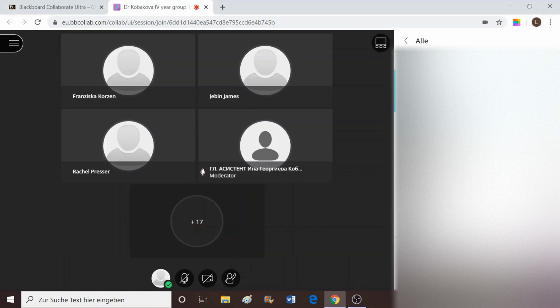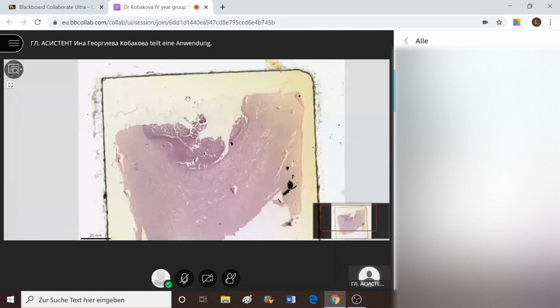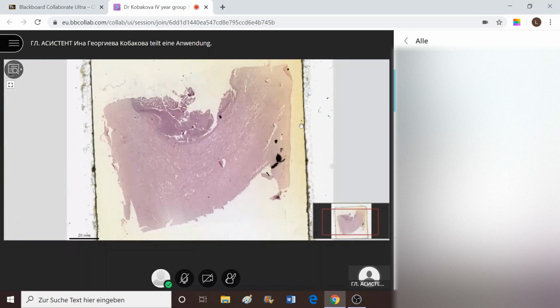That is also something that you have observed last year. The look of the slide is awful first. You can recognize it even by the look of this yellowish glass, which appears to be centered. So at least it's awful for me, but it's recognizable for you. But you will recognize it without this artificial look at the periphery of the slide.